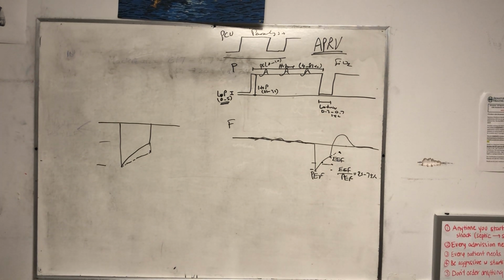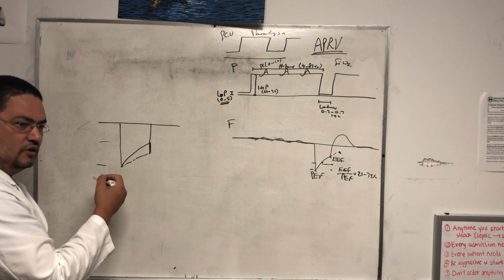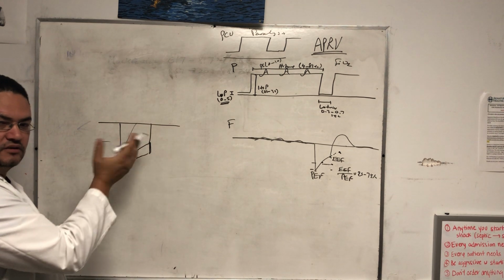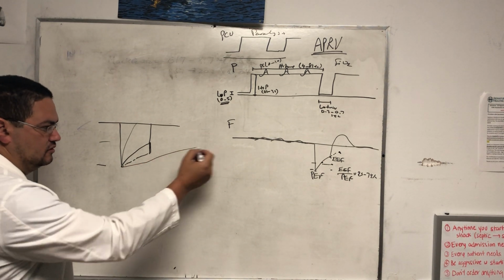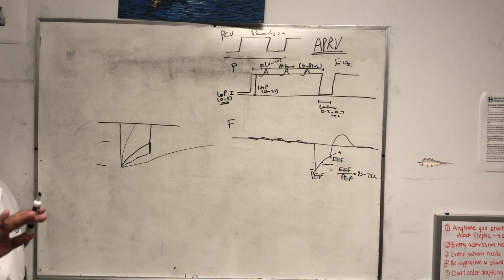So this one here, if you're an ARDS patient, your curve is going to look like this. The more ARDS, the faster the exhalation is, because it's so stiff and the lung finishes. If you're a COPD patient, your curve goes like this. So they're the opposite of each other, and the normal is in between. The more you move towards COPD, the more your compliance is improving. So the patient that you put on APRV, the compliance now is improving.